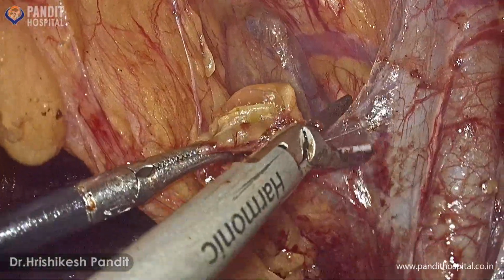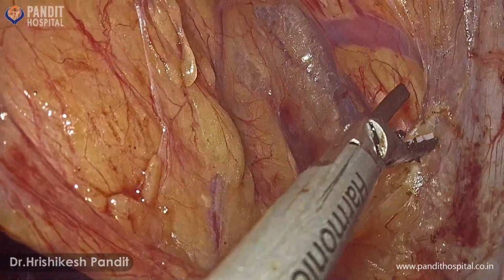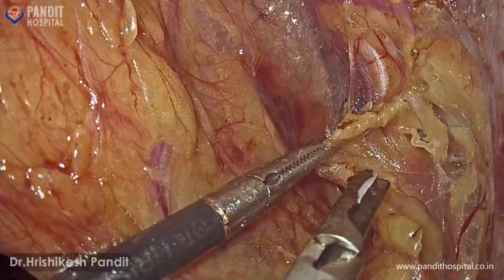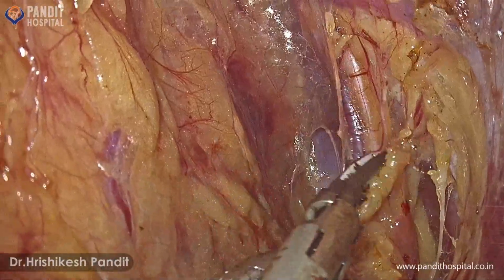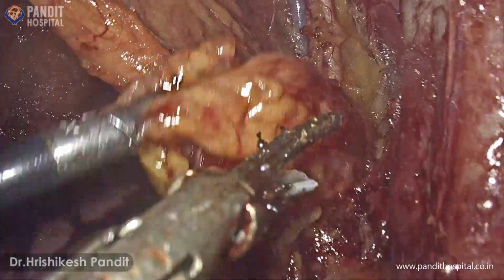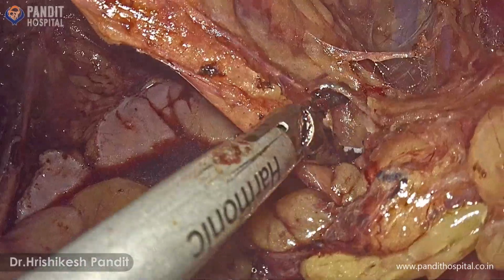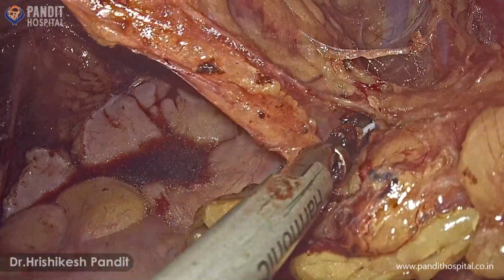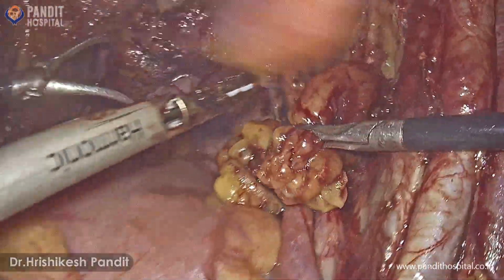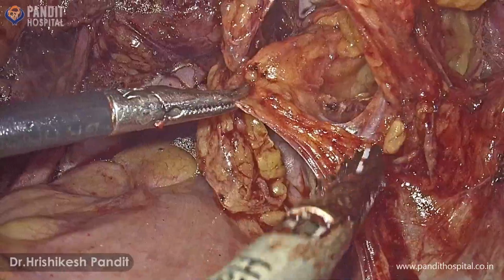Here we can see the white streak structure, that is the obturator nerve, along with its vessels. The medial limit of dissection is the obliterated umbilical artery, and the caudal limit of dissection is the obturator nerve. We need not dissect beyond the obturator nerve. We can see the obturator artery and the obturator nerve here.